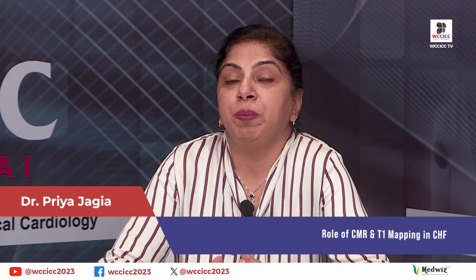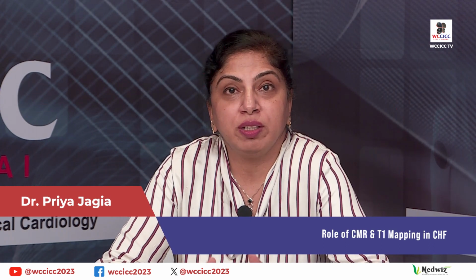So, in non-ischemic cardiomyopathy, cardiac MR can help take the clinician towards the etiological diagnosis depending on certain features. For example, if there is edema or subepicardial enhancement, the patient has myocarditis. Presence of granuloma, again with edema, and typical enhancement will make a diagnosis of sarcoid. Then in patients of restrictive cardiomyopathy, where echo cannot differentiate, or you have a query between CCP and RCM, here again cardiac MR is the investigation of choice to give you gold standard reference values for your myocardial function.